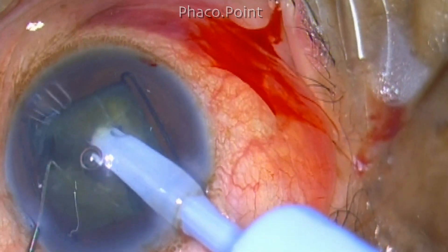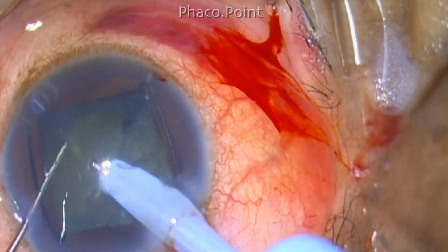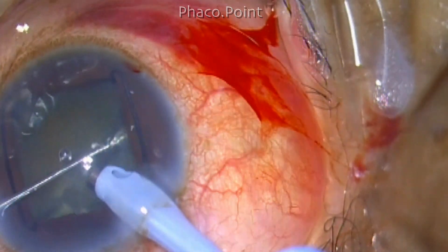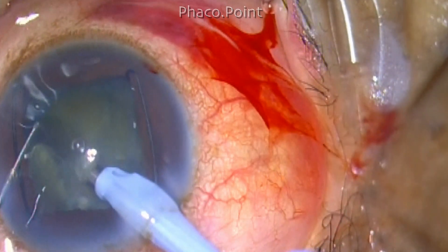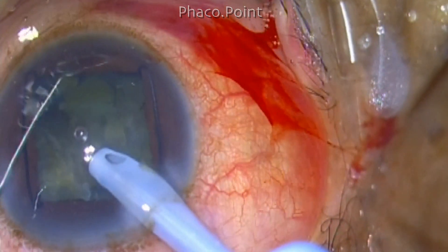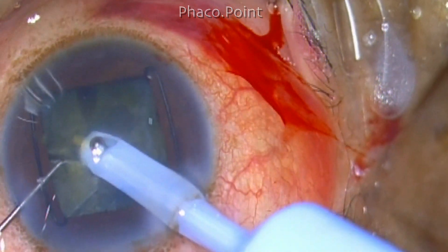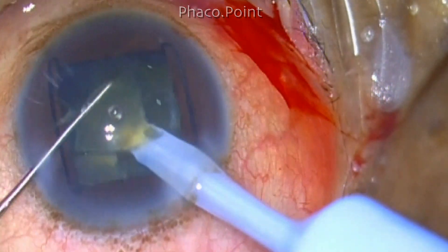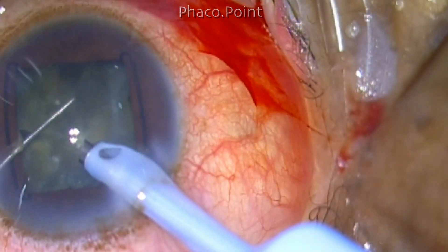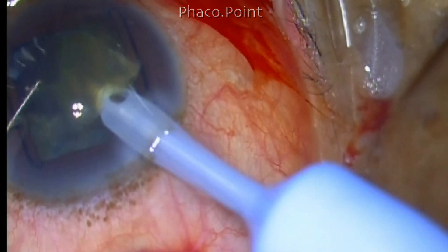In this case, although I am creating multiple small fragments with multiple chops and trying to separate them, because of the leathery nature of the cataract, the crack is not spreading through and through — the posterior plate is not completely split open. It opens like a flower petal, appearing fractured but the posterior plate remains intact. I realize this when mobilizing a fragment and finding it still attached posteriorly, reluctant to move forward. I therefore create a deeper crack and remove the central core.